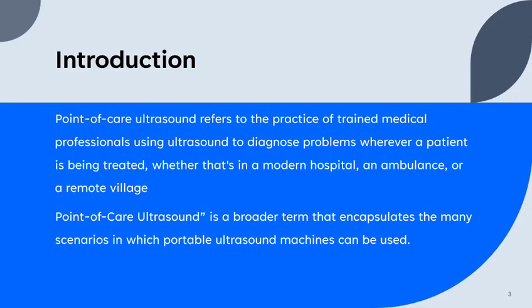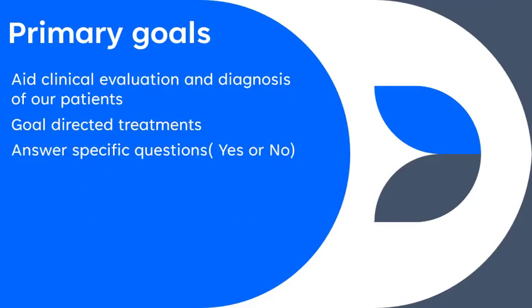The primary goals of point of care ultrasound are to aid clinical evaluation and diagnosis of our patients, to have goal-directed treatments, and to answer specific questions in a yes or no manner with the protocols that are provided by each system.